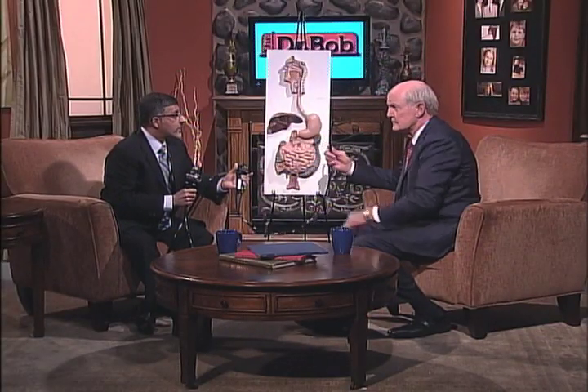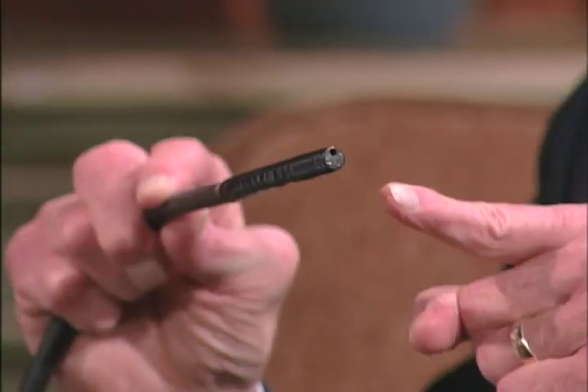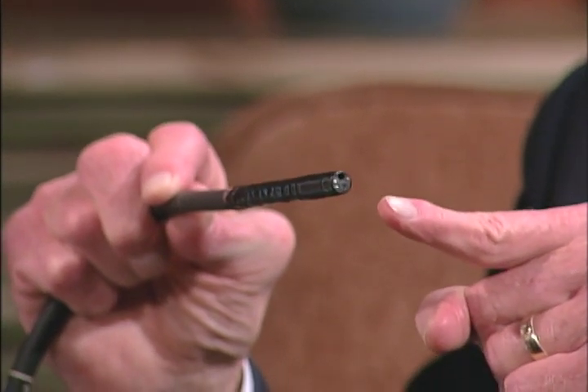Let's talk about upper GI. Let me see what you've got there. I'm going to carry this end. What end is this? That is the viewing end of the endoscope instrument. It allows us to see the inside, and that's what we actually insert into the body.